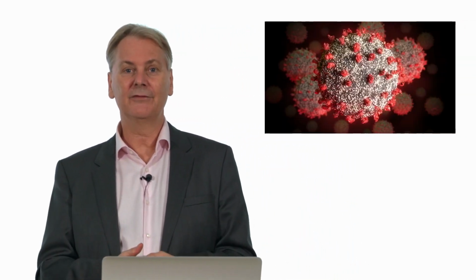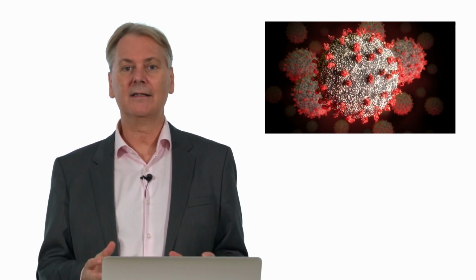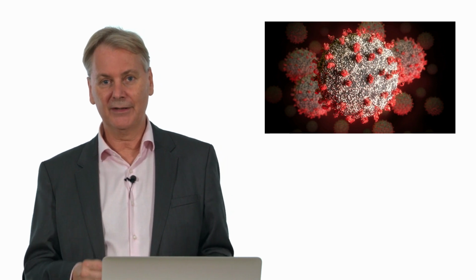can do with ultrasound. Maybe not part of the standard protocol, but even more important now in the situation we are in with COVID-19 infection. Let us show you some examples and discuss how ultrasound can be used in this setting. The first patient we want to show you is a COVID-19 suspect. Of course, we tested him, but before the PCR results were available, we also performed point-of-care lung ultrasound.